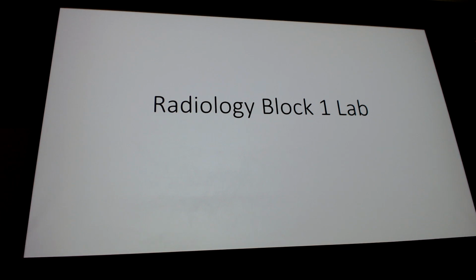Don't beat yourself up if something is like we talked about, right? There are a lot of ways to describe something. Like, it's clearly oblique and comminuted, I see that, but the word oblique is missing from the description. That's okay. It doesn't mean you're wrong. It just means that word wasn't given. I've given you a bunch of words to describe different things that you see so you can be as thorough as possible, but understand that not every word is always going to be present in a report, or needed when you're talking to somebody or when they talk to you. But if I don't arm you with the words, then if somebody says it to you, you have no idea what they're talking about, or vice versa. So I have to give you all that information.